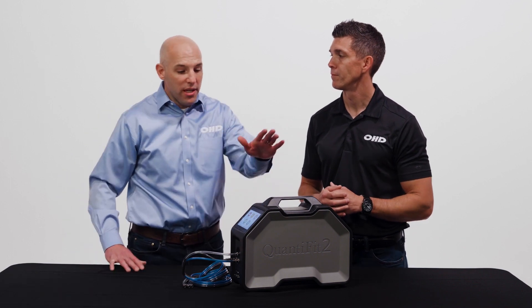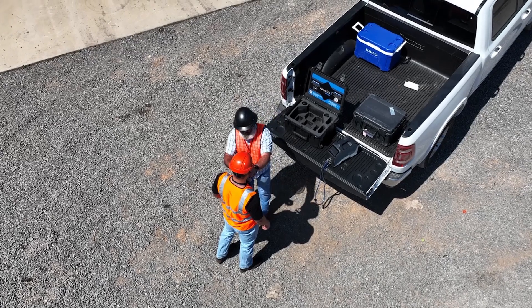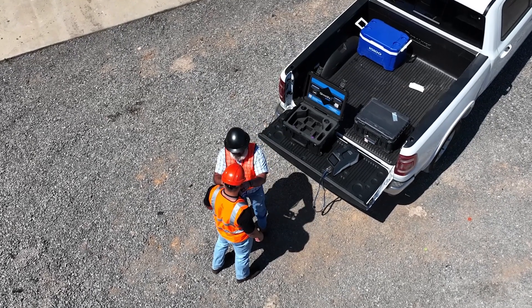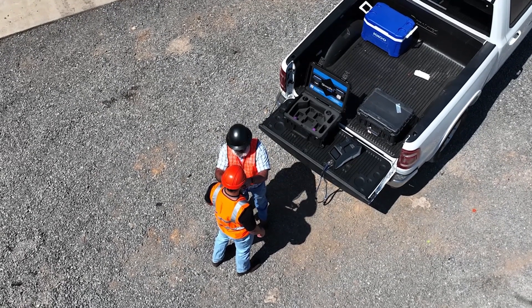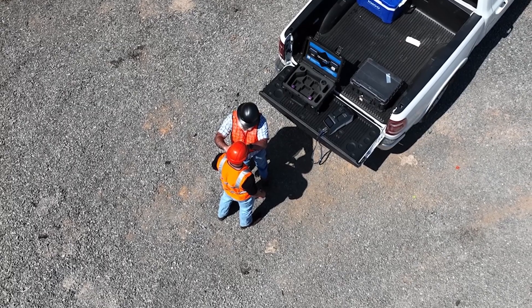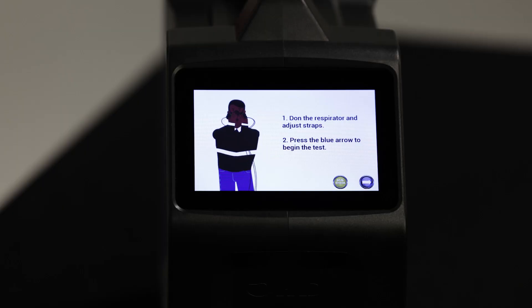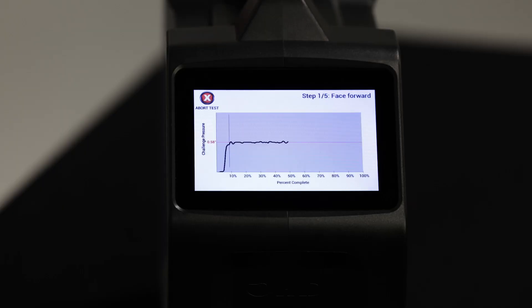Moving to innovation — the first highlight is the onboard data capability of the QUANTIFIT II. It can store virtually unlimited companies, unlimited test subjects, and unlimited test results on the instrument itself. The device can also be run off mainline power or battery power; it has a lithium-ion battery that on a complete charge can complete around 80 fit tests. The user interface is primarily driven by a color touch screen with infographics and animations that support you through the testing process. The color touch screen even allows you to gather a signature of the operator and the test subject if desired.